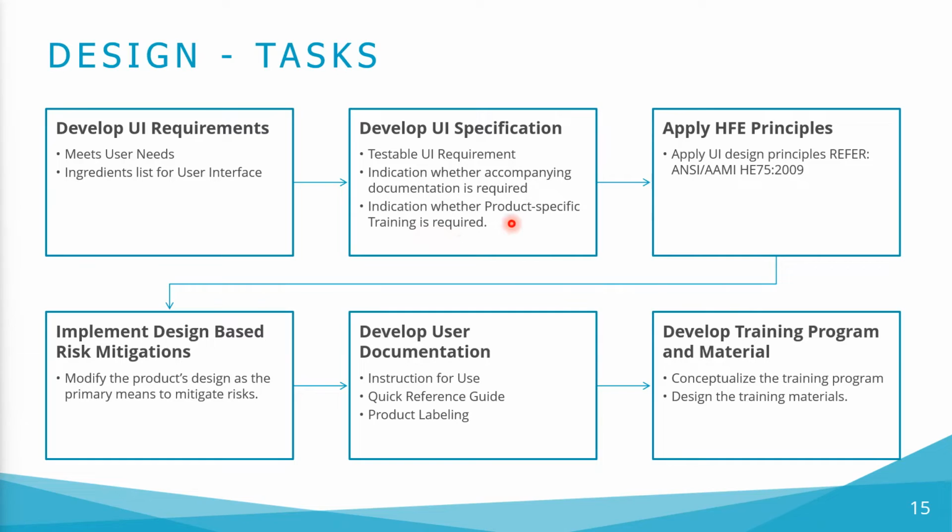Develop UI specification, primarily to satisfy a requirement set forth in IEC 62366. We must develop a UI specification that includes the following elements: testable UI requirements, indication whether accompanying documentation is required, and indication whether product specific training is required.